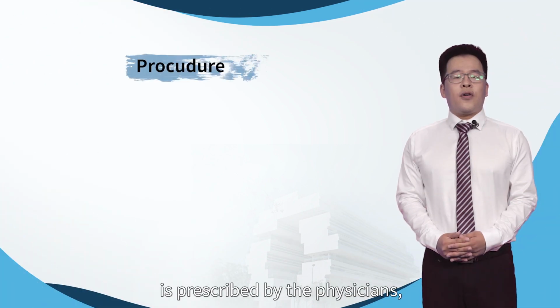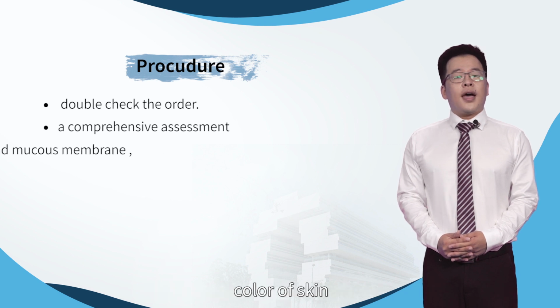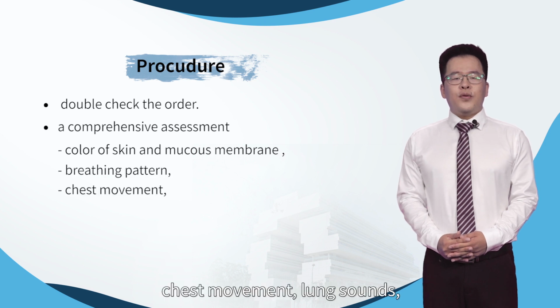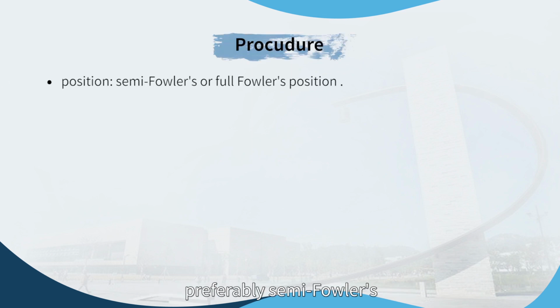per minute. When oxygen therapy is prescribed by the physician, the nurse should double-check the order, then conduct a comprehensive assessment of the patient, including color of skin and mucous membrane, breathing pattern, chest movement, lung sounds, signs of hypoxemia or hypercapnia, and lab findings, etc. The nurse should place the patient in a comfortable position, preferably semi-Fowler's or full Fowler's position, to assist breathing.